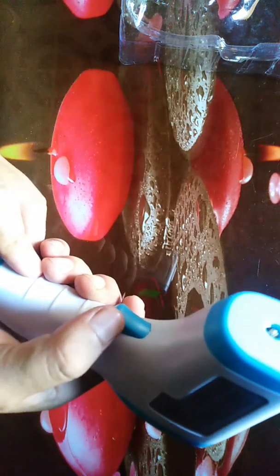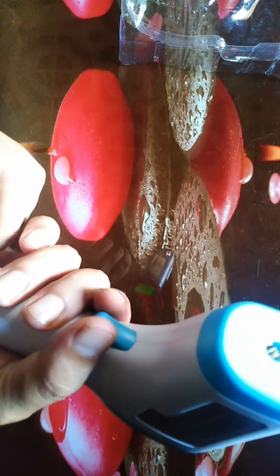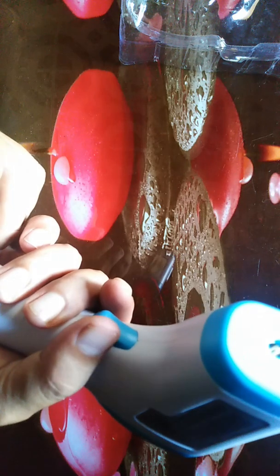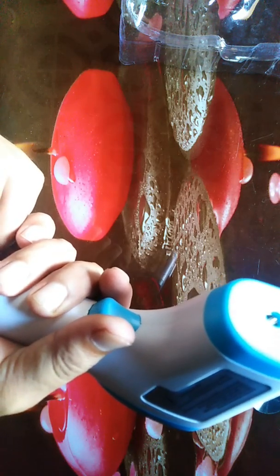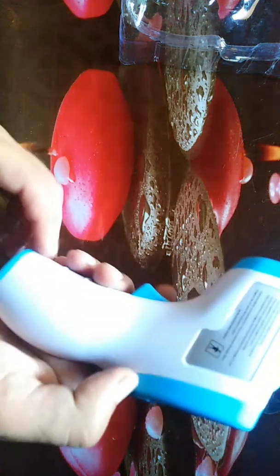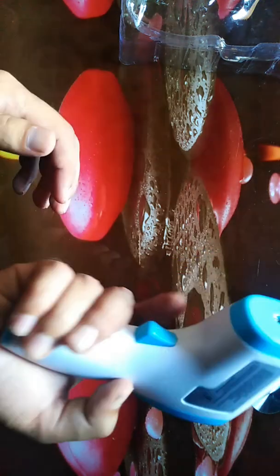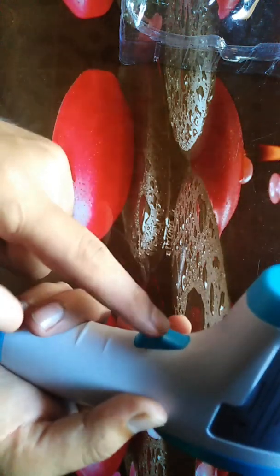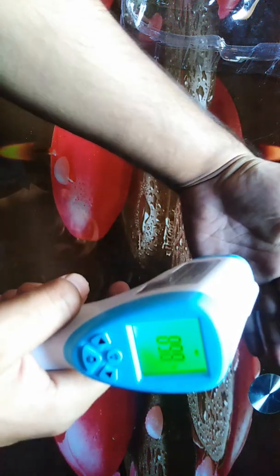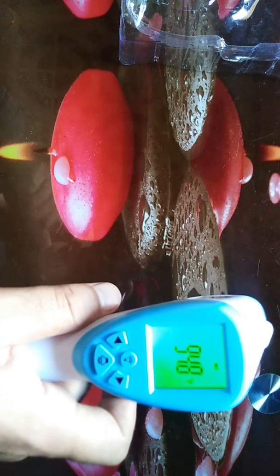You press this key to take a reading, as you can see here. For on and off, you can also use this button — just press it to power on, and after 60 seconds it will turn off automatically. To measure temperature, press the measurement key and you can see the temperature of the body displayed.